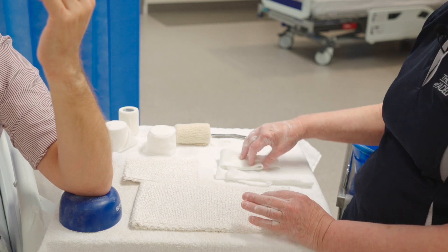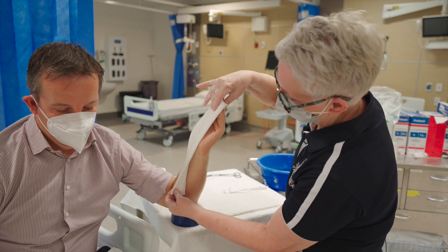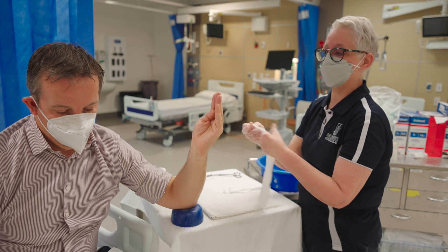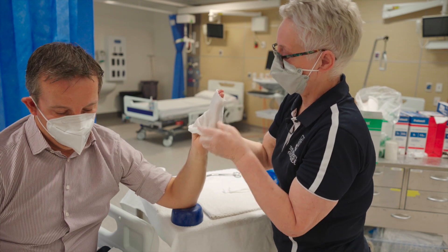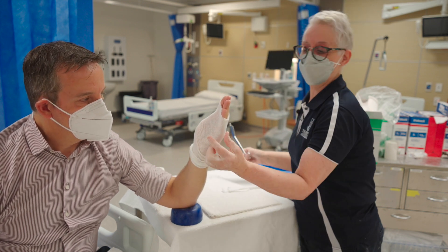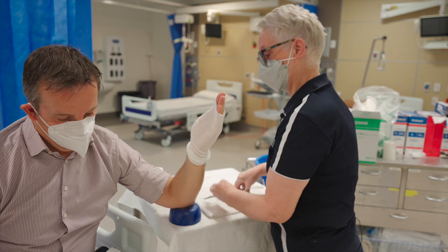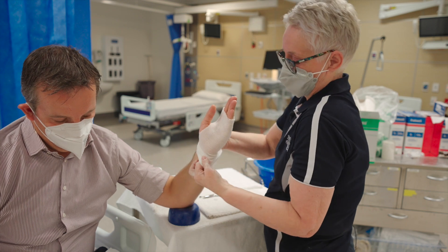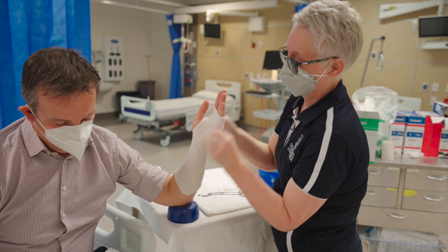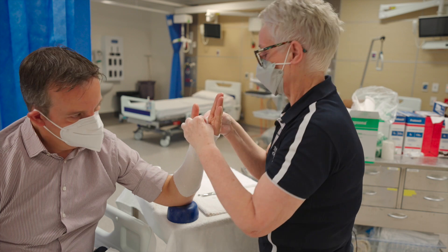We'll apply the stockinette first. Measure from the fingertips down to the elbow, then cut and slide the piece over the hand. Bring it down a little further since the slab will go down here. Put a small hole in for the thumb, take that through gently, and bring it down. Lift the edges away from the arm and the hairs of the arm, then fold the edges as shown.